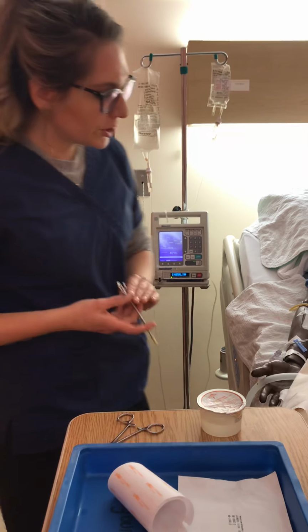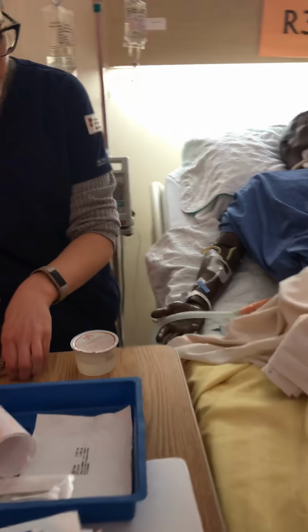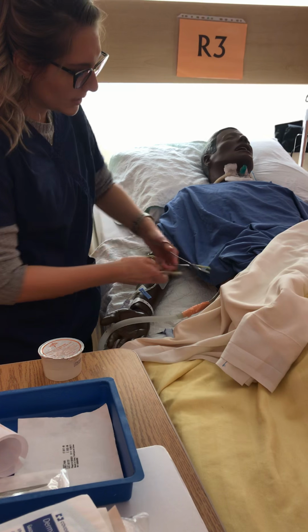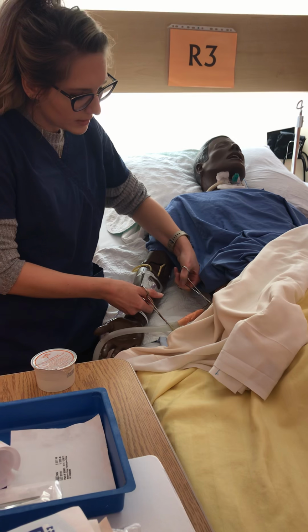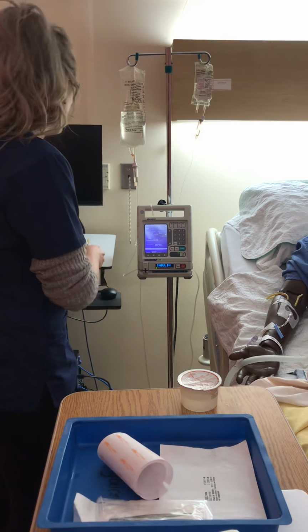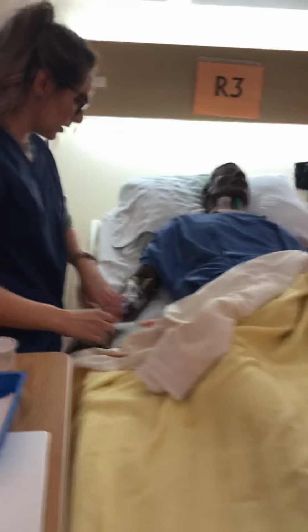So what I'm going to do to check in case there were an air leak, I go closest to the patient, so it is stitched in up till here. So this is what's closest to the patient. Now just take it here. If the continuous bubbling stopped, I'd know that the air leak were in the patient. And then if not, I'd go in continuous intervals down the line just to make sure that I've got the air leak. And then I notify the physician as soon as possible.